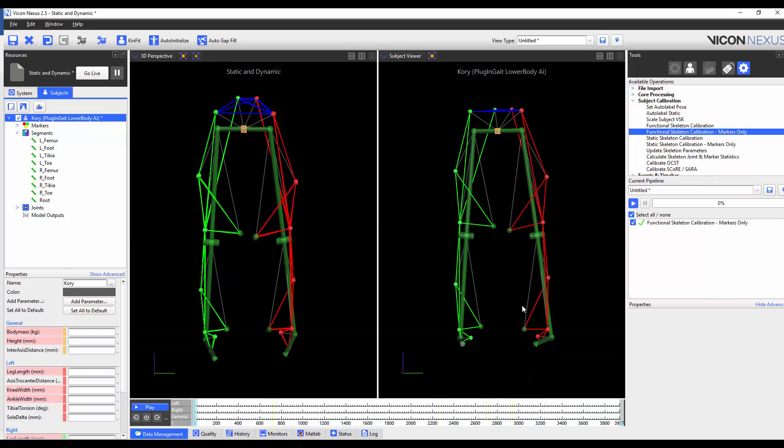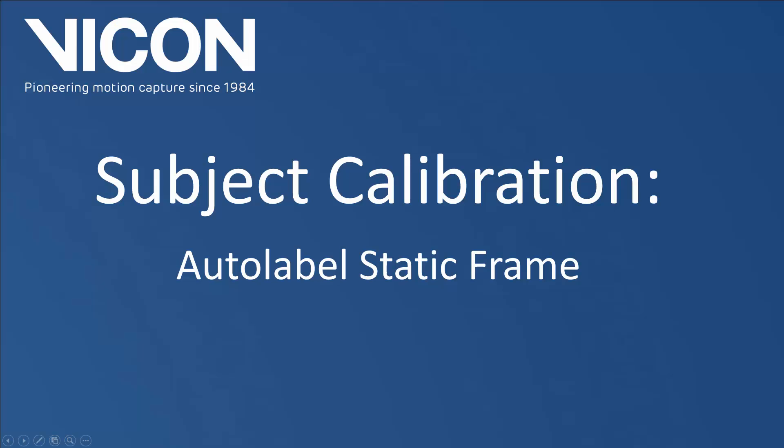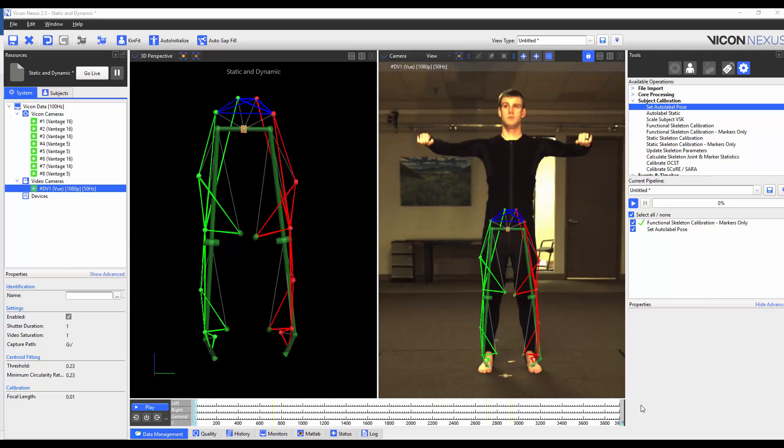When this operation is complete, we will see the markers correctly align. We are now going to make sure that we're on a frame where the subject is standing in the base pose. We're then going to execute the set auto label pose pipeline operation so that we can try to use the auto label function for other subjects.